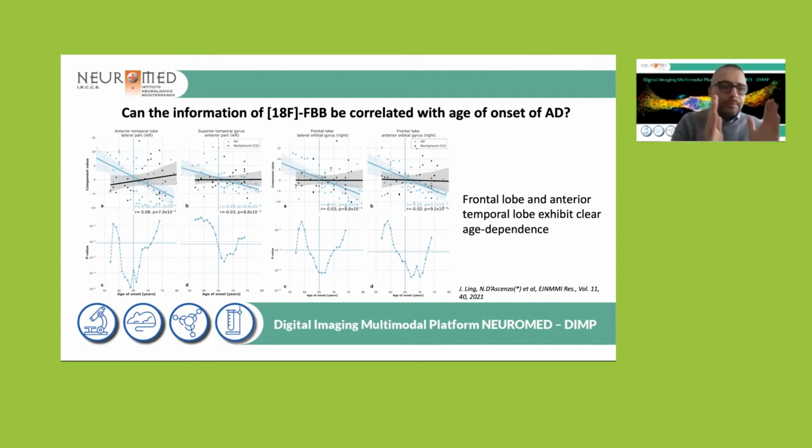In particular, here in blue you have the Alzheimer's disease patients, and in black the background, the control group of patients without Alzheimer's.